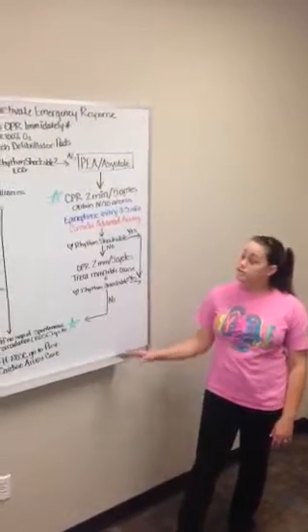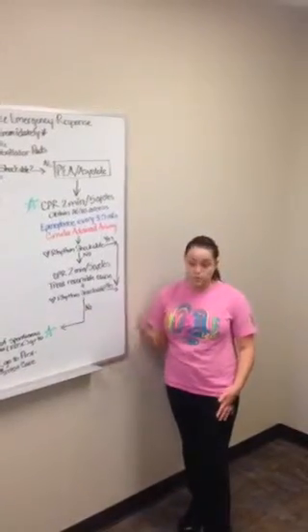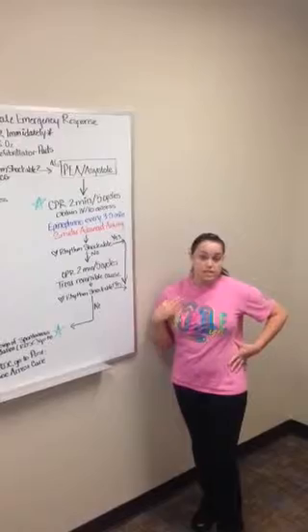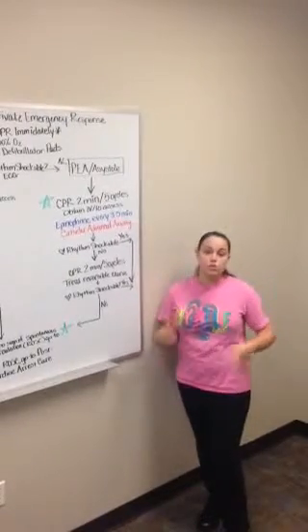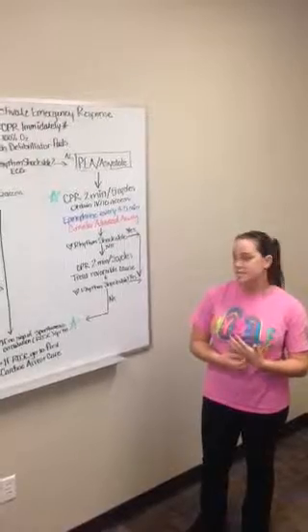Also, just wanted to give you some information about monophasic shock. It is just one big jolt of electricity going from one side to the other. It's a little bit harder on the heart, so it's really not commonly used in the United States.